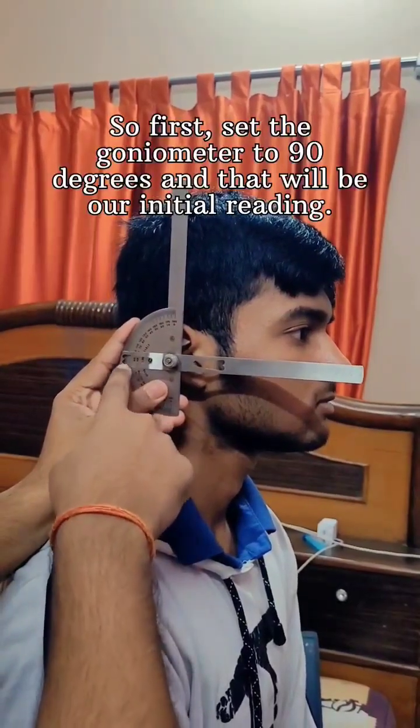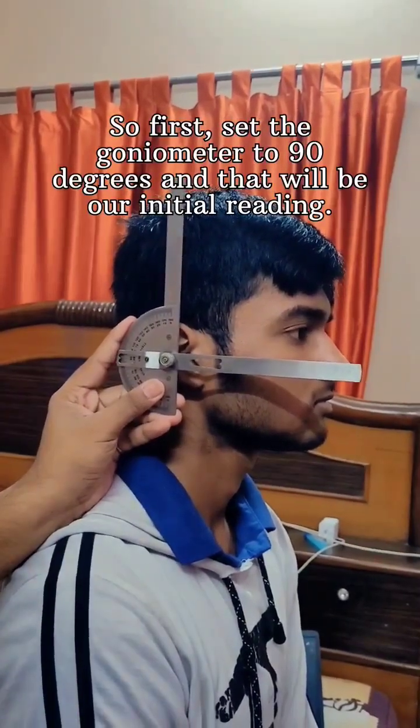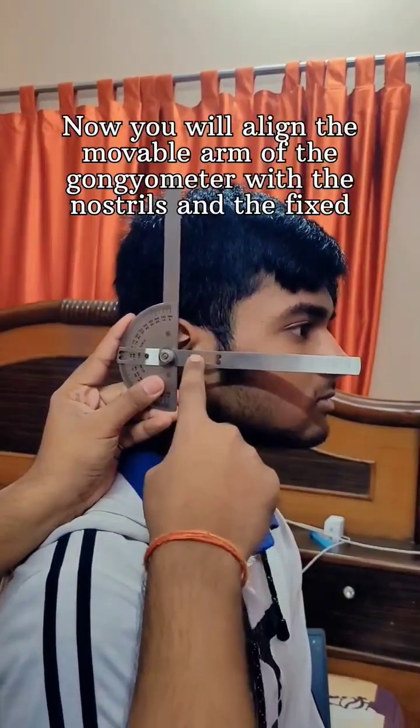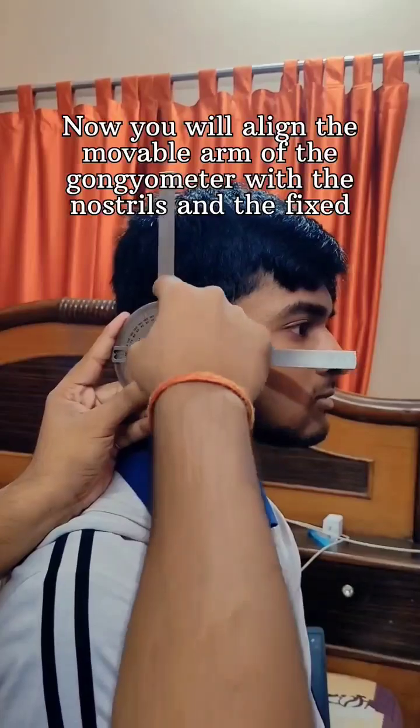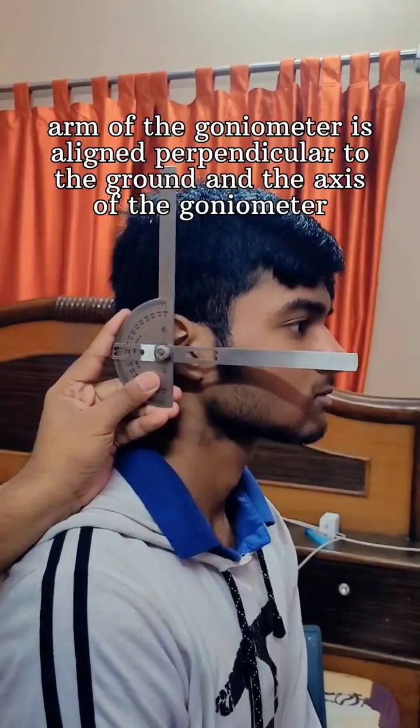First, set the goniometer to 90 degrees — that will be our initial reading. You will align the movable arm of the goniometer with the nostrils, and the fixed arm of the goniometer is aligned perpendicular to the ground.